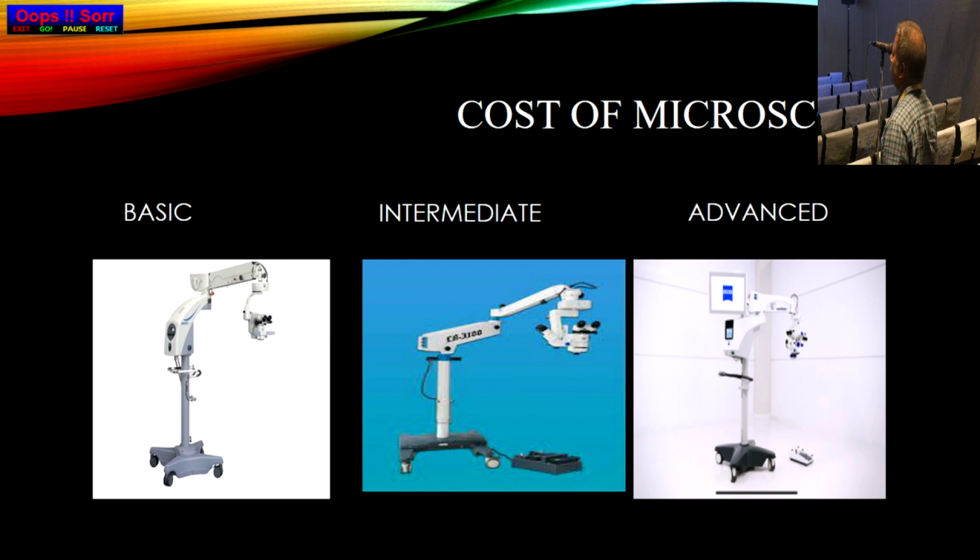In doing SICS, I have no problem with any microscope. But with phaco, as we go near the posterior capsule, the red glow should be there, which is deficient in the Takagi microscope.